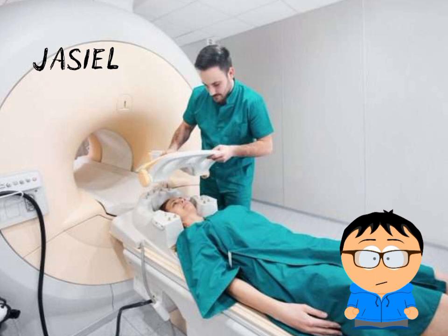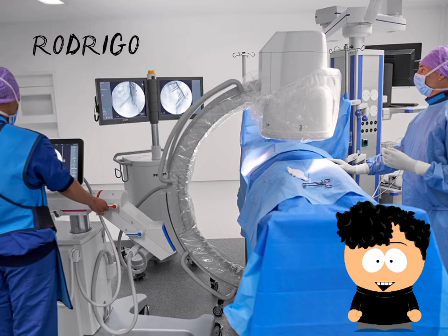Display screen, which displays the generated images and allows the attending physician to analyze them in real time. 7. Imaging software, programs that assist in viewing, analyzing, and storing the images obtained. These components work together to provide detailed and accurate images of the interior of the body.